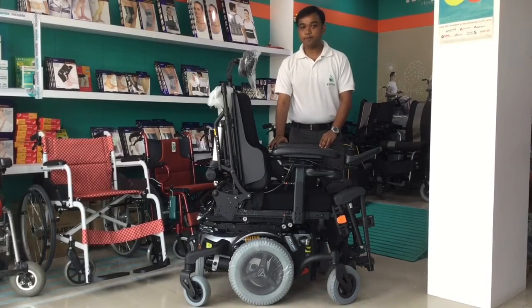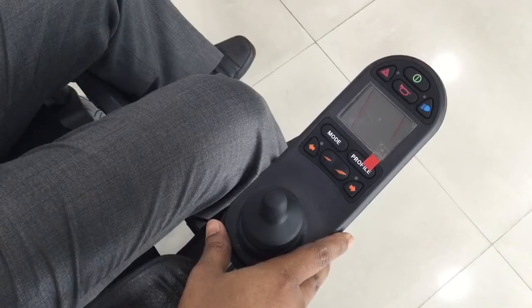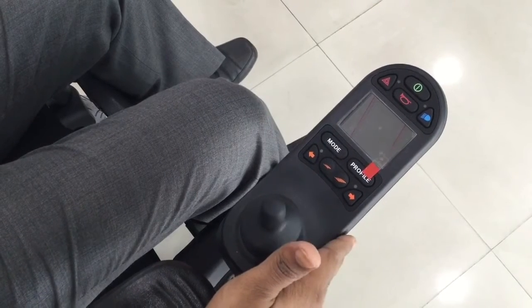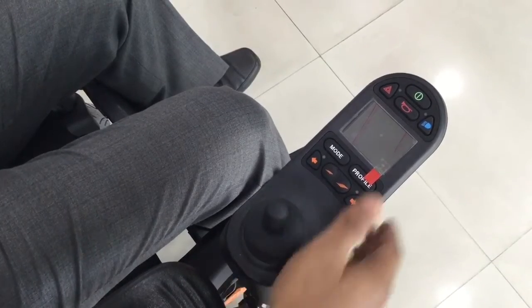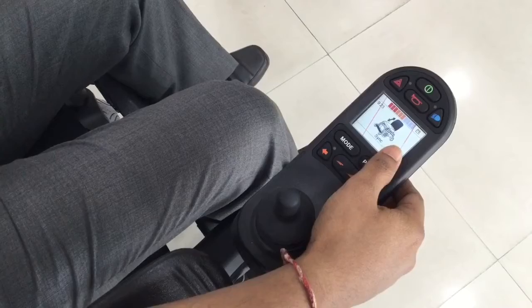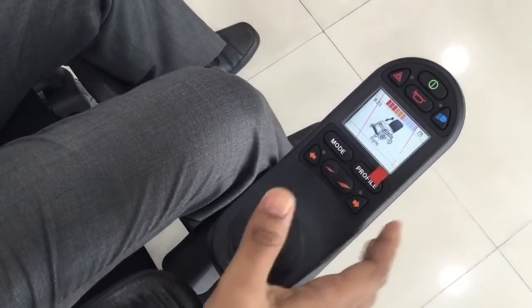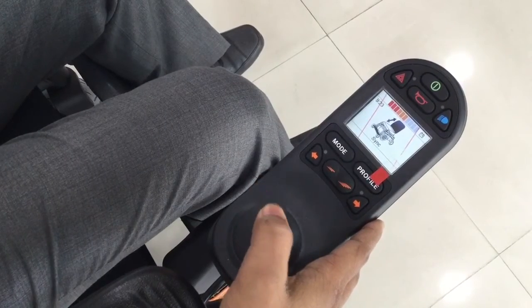We already know that the joystick is a very important part of a power wheelchair. Karma introduces a very high-end joystick in the Morgan Kicks. It comes with a digital display — first of its kind in the Indian market — and it also has different modes. With this knob, you can change the different functions very easily.